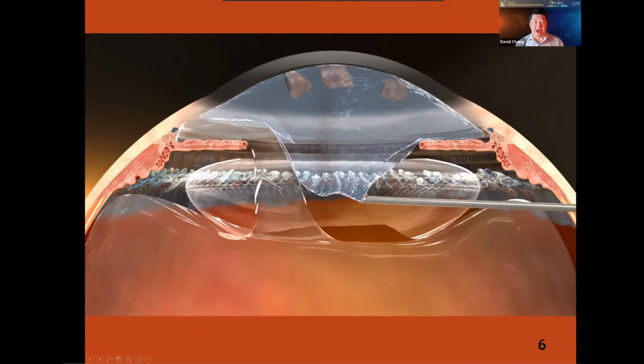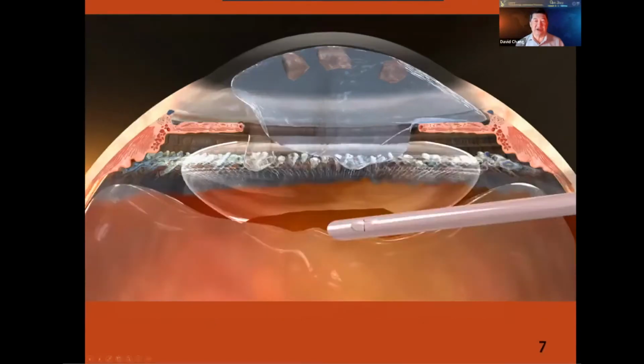We know there's probably vitreous, as you see here, but if I can push these pieces up against the cornea or over the iris and fill the anterior chamber with a dispersive viscoelastic that resists aspiration, then I will prevent these pieces from falling back when I do the vitrectomy, because this is the problem. In the absence of the posterior capsule, it's the hyaloid face that supports all the fragments. And when we do our vitrectomy and cut away the vitreous, we lose the support and the pieces drop posteriorly.